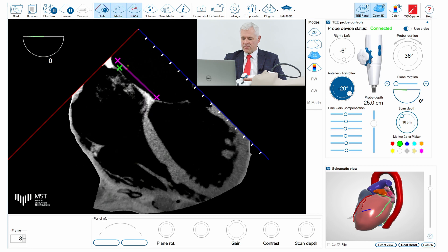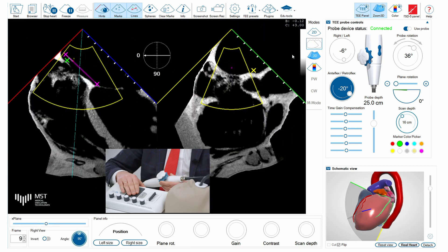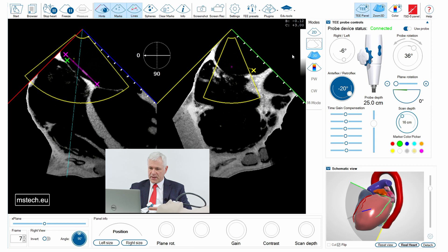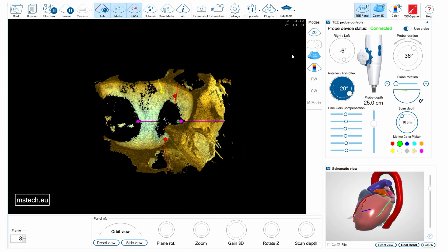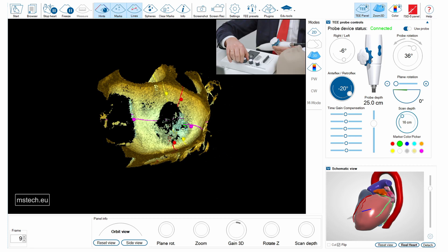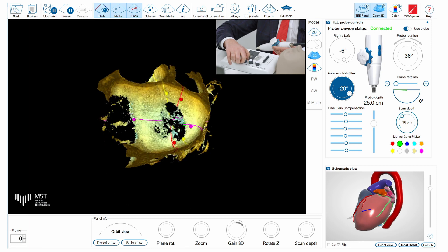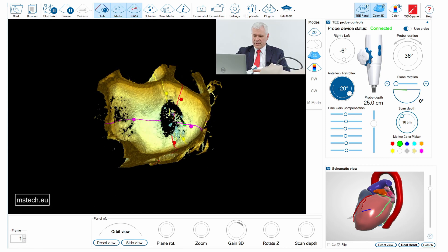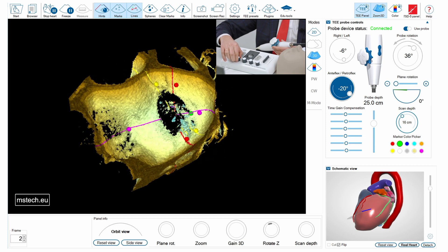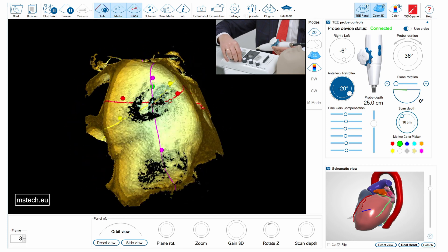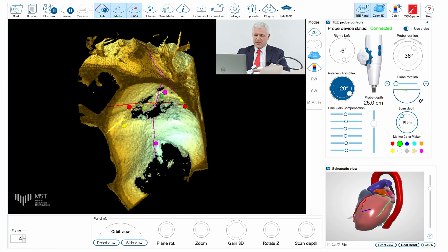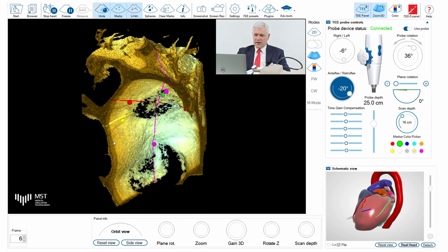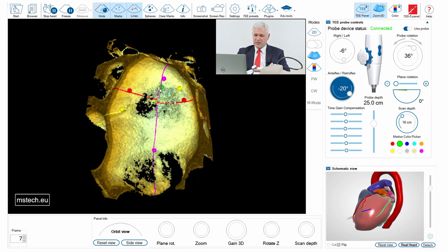Now let's have a look in 3D at how this looks — the mitral valve together with the septum in 3D space. I'm activating the 3D and here is my fossa ovalis and my mitral valve. I'm increasing the gain to obtain the best possible image, and I'll also rotate the Z axis to have the mitral valve down. We can see the mitral valve opens nicely — here is the commissure, here is the aorta, and my green point is the proposed puncture site for this valve.